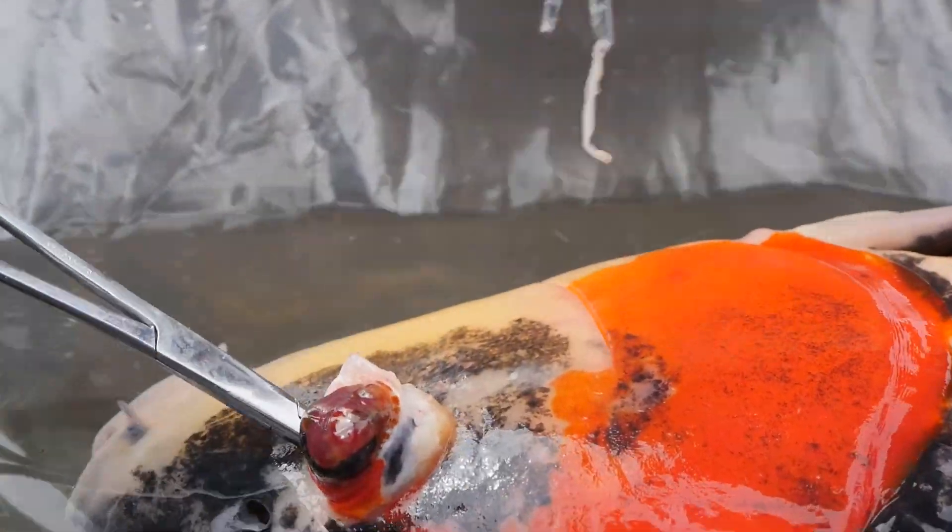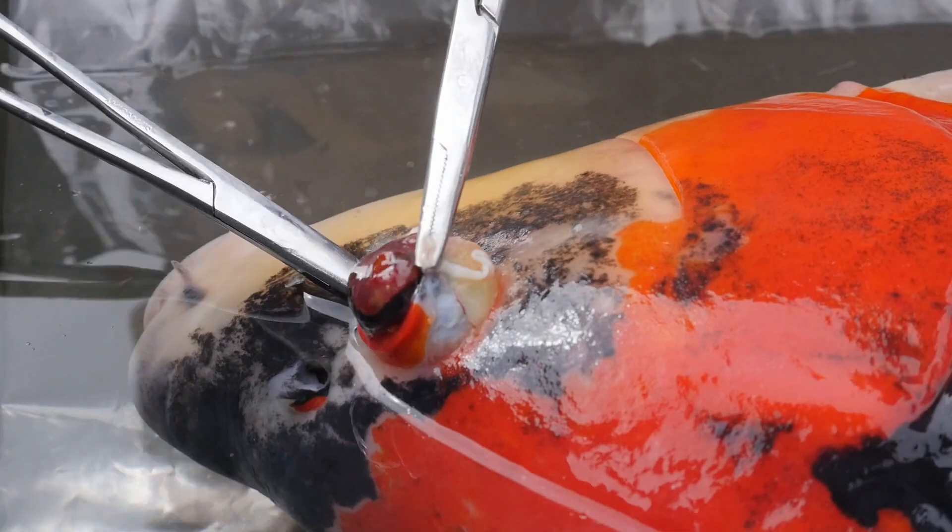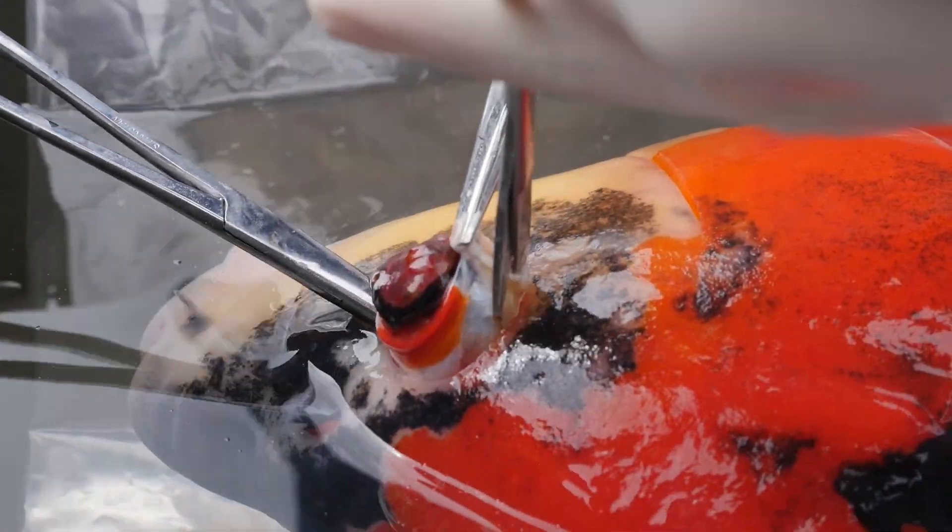It's muscling out a bit. I just have to make sure I get all the muscle attachments under this little layer of fat.